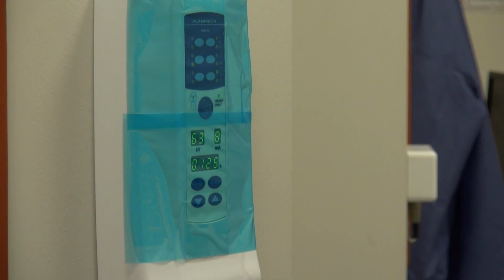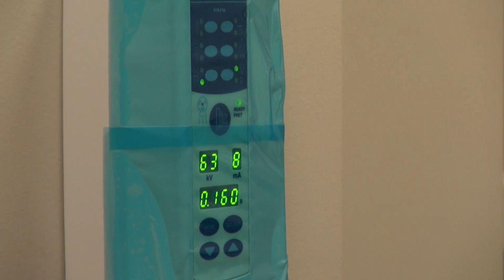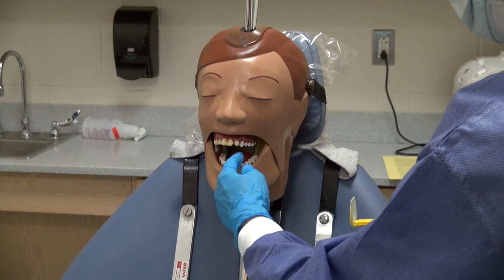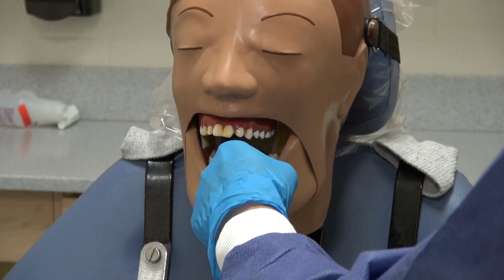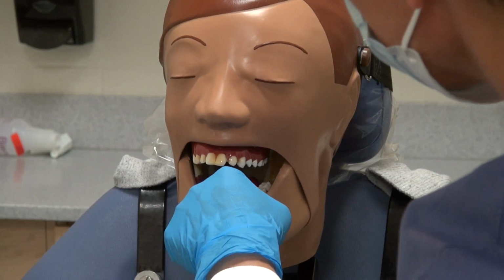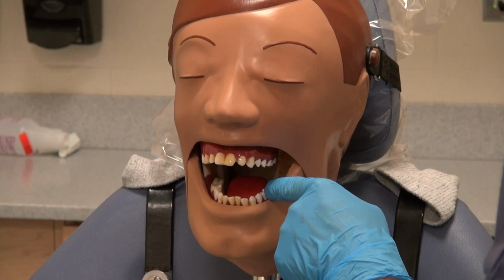Recalibrate at the control panel for the mandibular molar periapical icon. One of the things that helps with this film placement is to feel how deep the floor of the mouth is by putting your index finger on the linguals of the molars. You can tell the patient that this is where the film is going to be placed. You want to look in the patient's mouth and evaluate it. This patient has partially erupted third molar, first and second molar, and we will be getting the distal of the second premolar in the image.